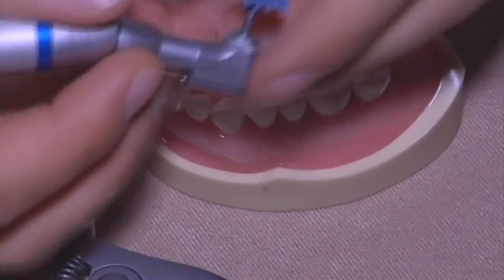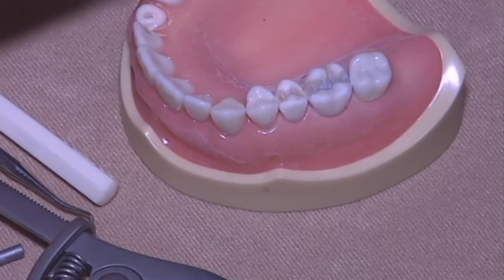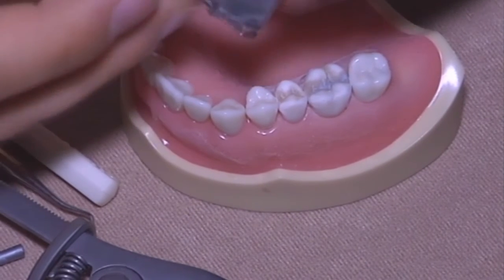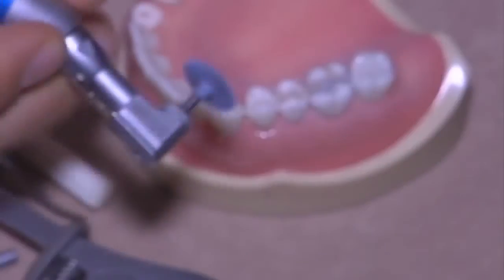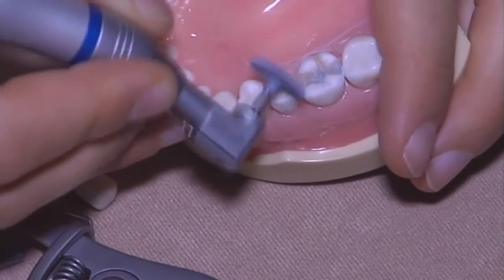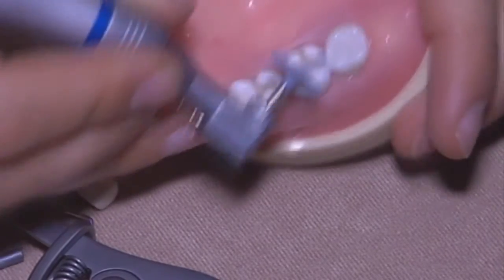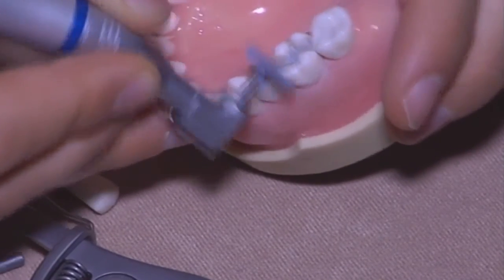Okay, you can collect a lot of debris, no problem, because once you pass with the other one, you will clean the cavity and you will clean all the restoration.